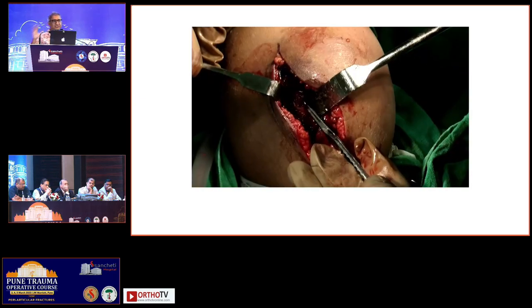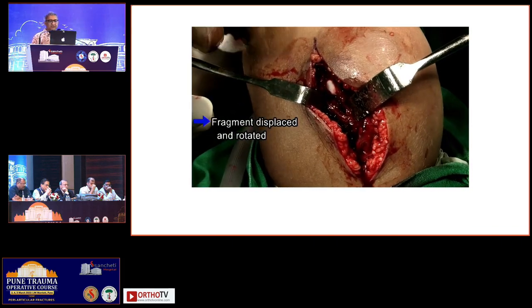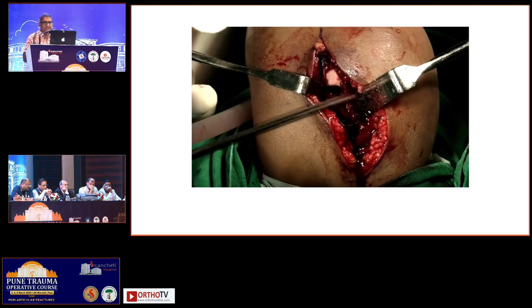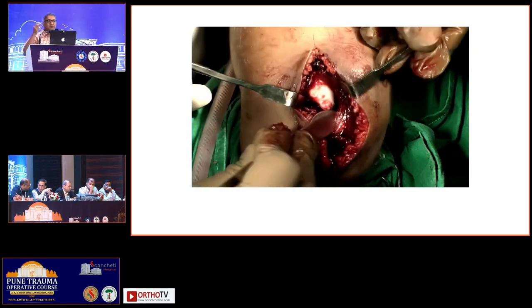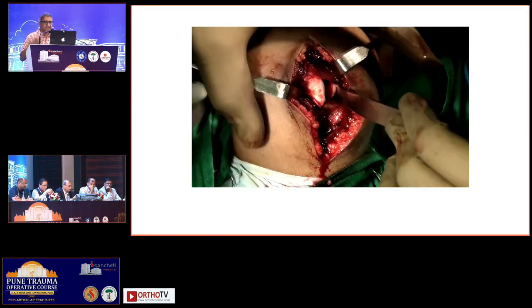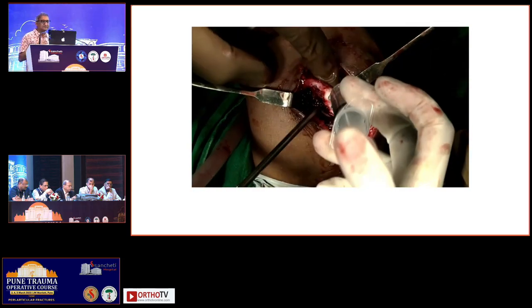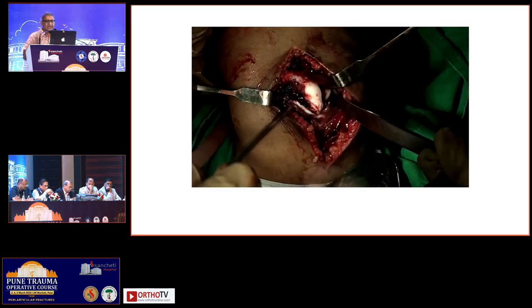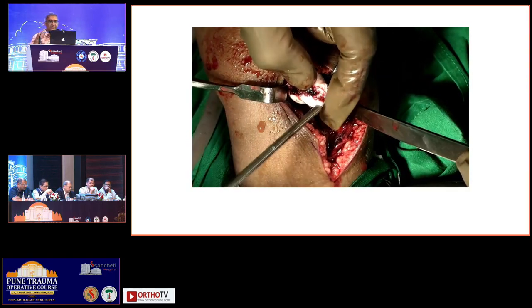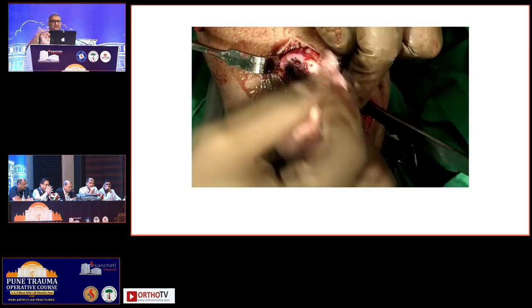So I feel this is much easier than doing an anterolateral approach to the lateral condyle. You see the articular surface, you see the fracture fragment very easily, and you can drain out the hematoma. Most of the humeral condyle is posterior, and that's why this becomes very easy. You can put in the spikes and you can see the fracture surface here. You have to keep the attachment of the muscle to this fragment intact. And this fragment is completely rotated. The fracture surface is facing laterally, the articular surface is facing medially.